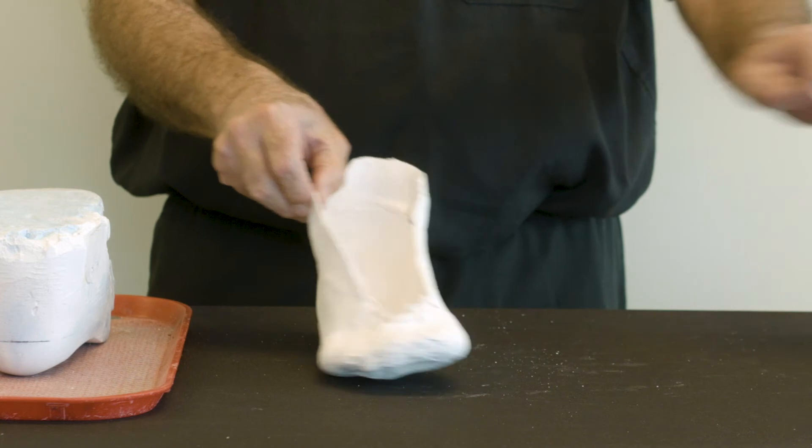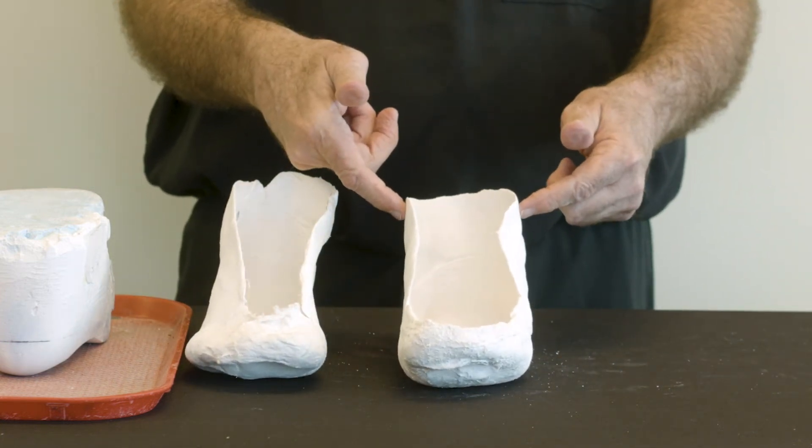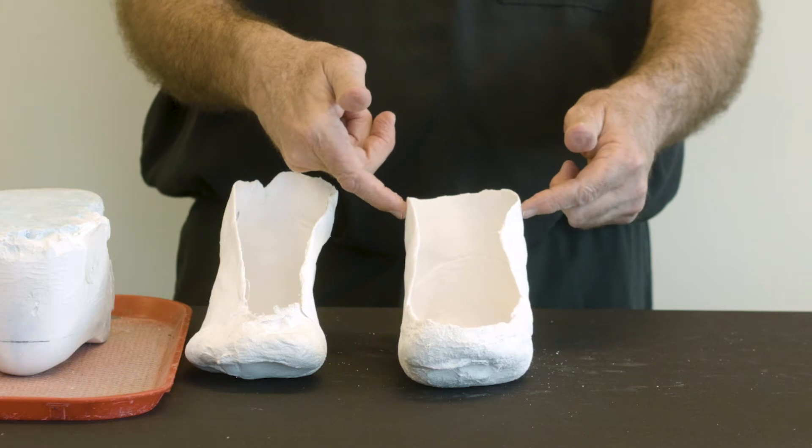This plaster cast was done properly. It has solidified, it's stable, and the anatomy is captured accurately.